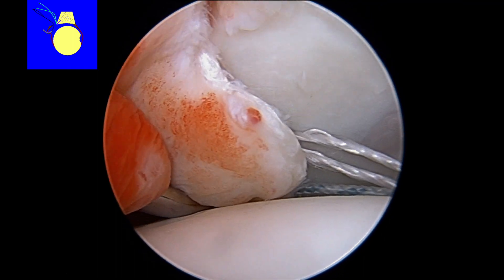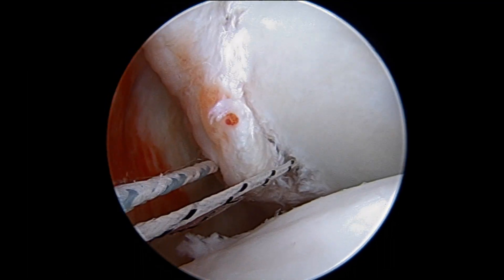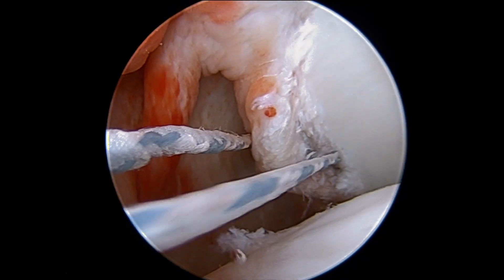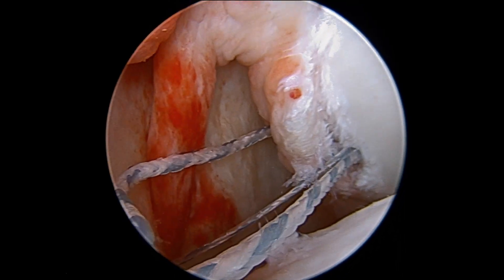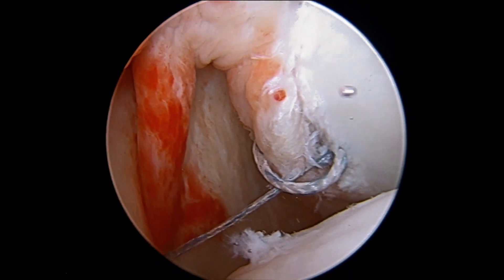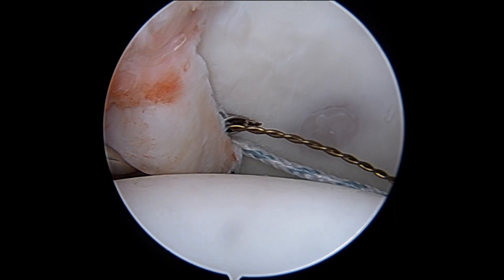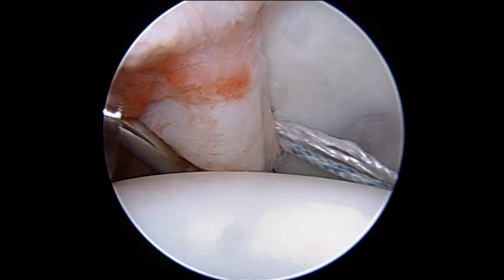Then we're going to pass our sutures through the labrum and ligamentous complex using special passing devices. I'll thread that suture back through my knotless mechanism, which has already been embedded in the cup or glenoid of the shoulder. As I tension that down, it anatomically reduces the labrum and ligament to the front of the cup of the shoulder or glenoid.